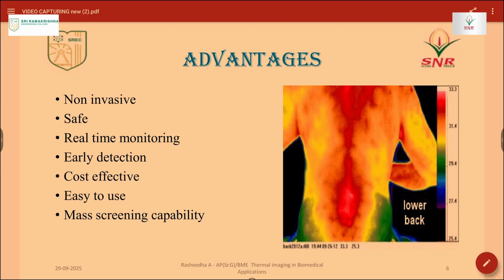Yes, it is true. Early detection of abnormalities by identifying the temperature variations associated with inflammation, infection or tumors can also be done here. This technology provides real-time monitoring, which is valuable in tracking blood flow, wound healing and rehabilitation progress. It is versatile, being applied in cancer screening, fever detection, vascular studies and physiotherapy. Moreover, thermal cameras are portable and cost effective, making them suitable for clinical as well as remote healthcare use.